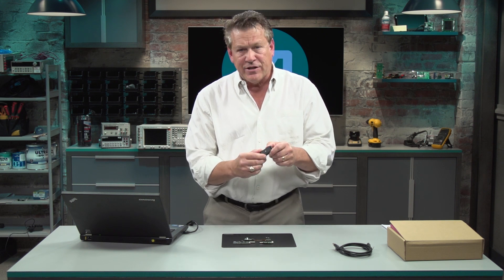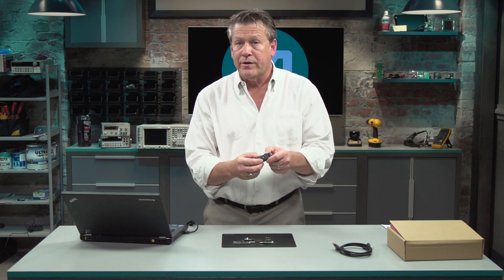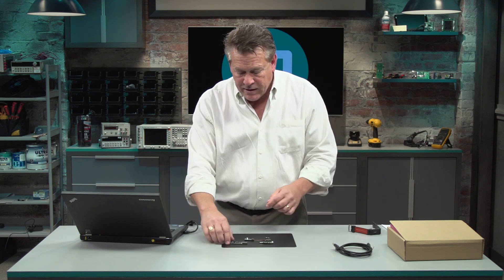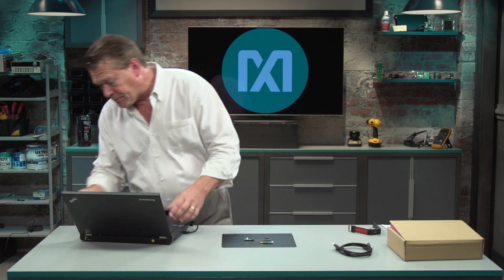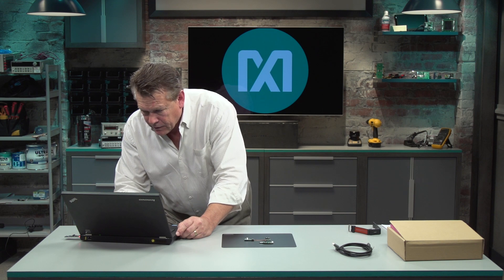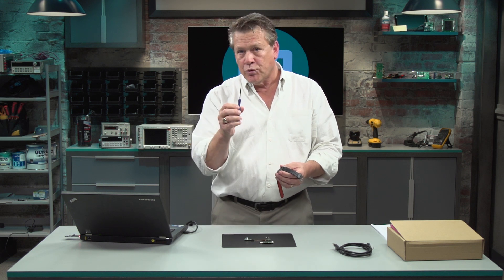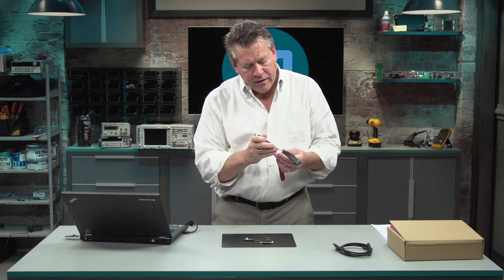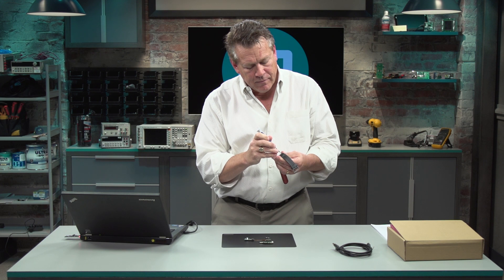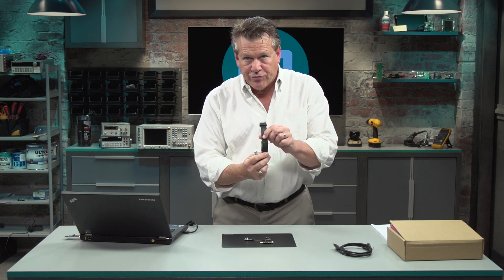In this unit we have the MAX86141, and I will demonstrate how to get the GUI up and running and turn on this unit. We need the PC, a Bluetooth PC dongle, and we turn on the GUI. We need a tool with a flat edge to depress the on-off switch — a surface mount switch inside the wristband unit. The green light shows you that it's up and functional.